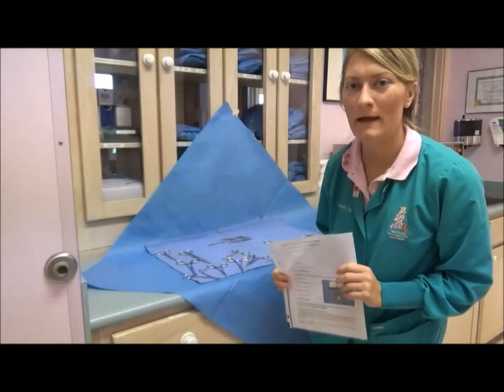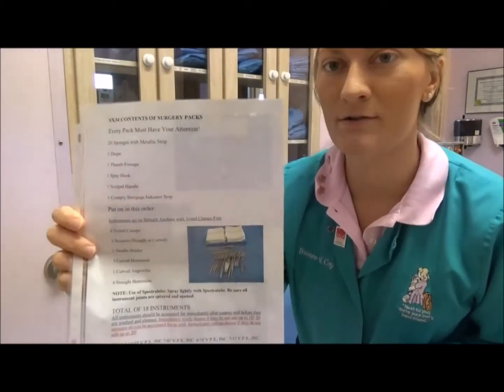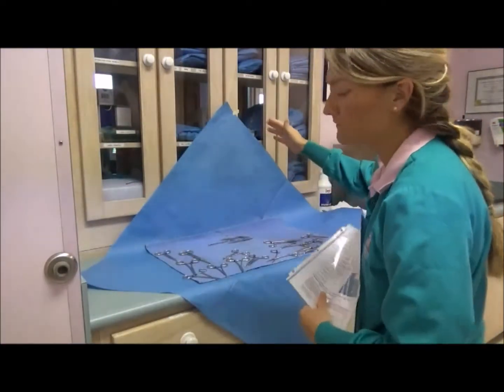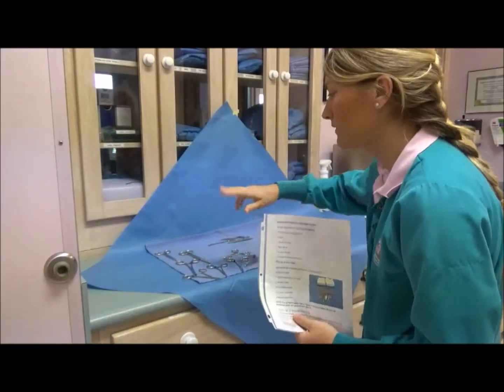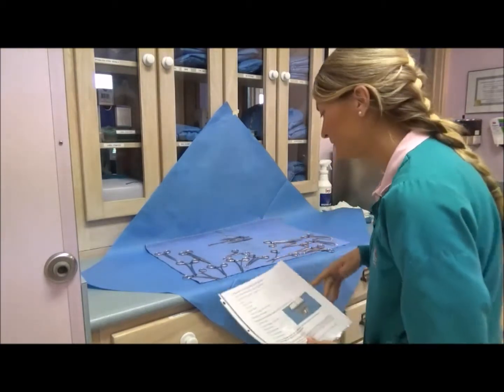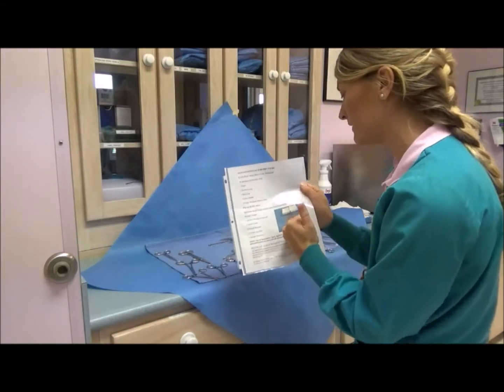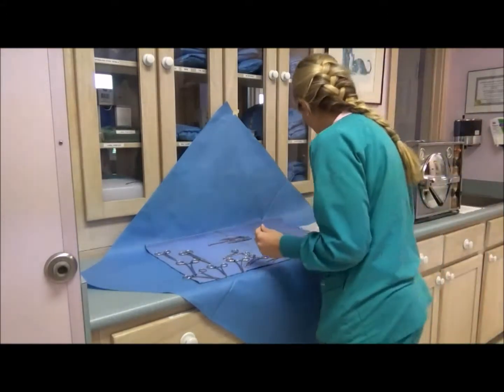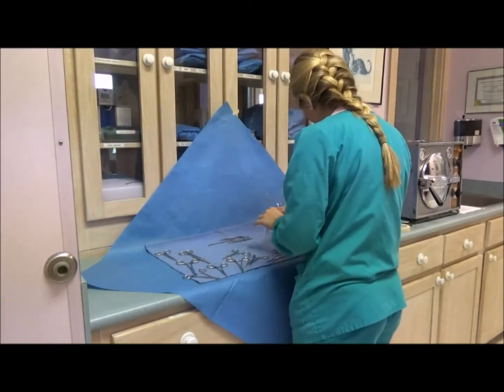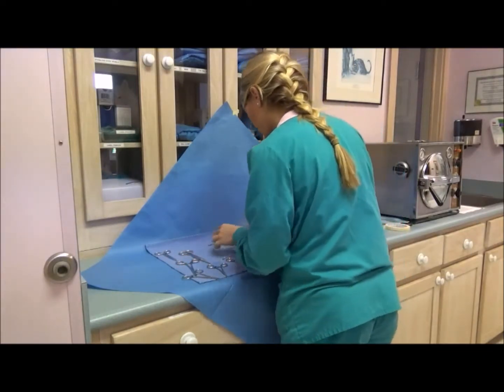To prepare a surgical pack, I always follow the template our hospital uses for preparing a surgery pack. With this, the first thing you want to do is cut out a piece of disposable drape. We use a paper disposable material, and then you always want to line it with a lint-free towel, and then you just go in the order as far as how to place the instruments. So I'll just go through that. Straight up there. 4 towel clamps.